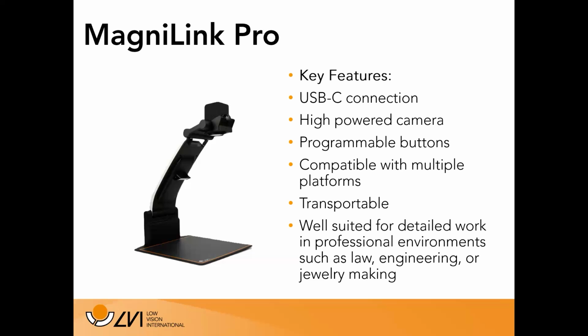This device is not 1 pound or 4 pounds like the Mini or the S. However, it is transportable. It folds down similarly to our Magnilink Zip and our Magnilink One products and fits in the same size case and is not difficult at all to move from one location to another.